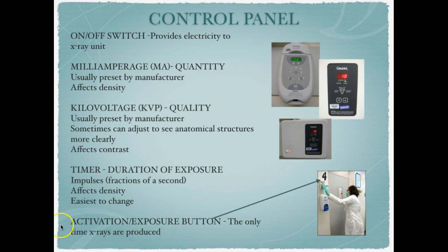Another part of the X-ray unit is the activation button, also known as the exposure button. This is normally positioned outside of the room of the dental X-ray unit because we, as the dental radiographer or the operator, are around X-rays much of the day. We usually take X-rays on many patients during the day.